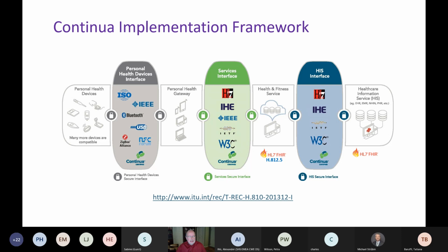So we adopted the IEEE 11073 family of standards that tells you very specifically what, why, where, and how things were measured, and that includes sufficient information to make clinical decisions.